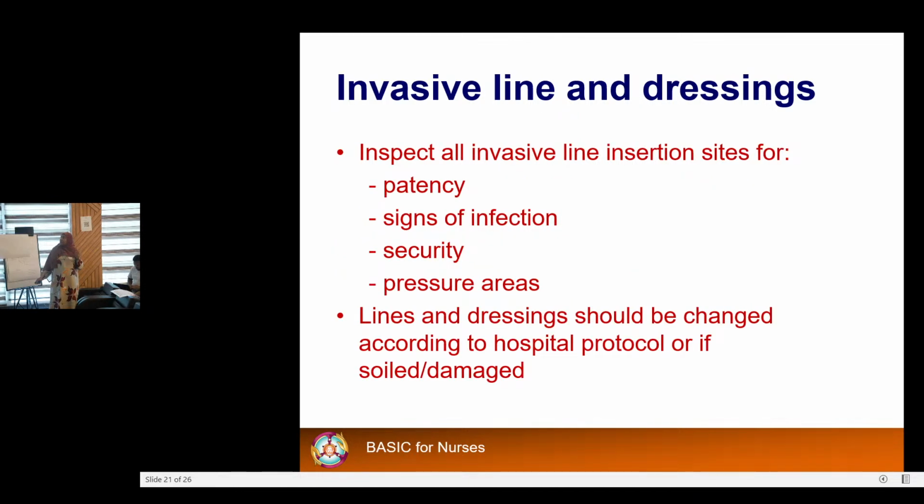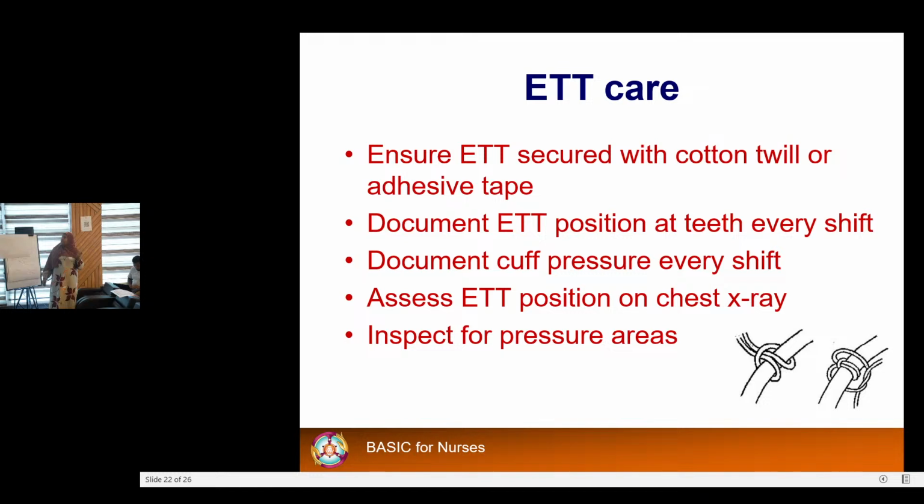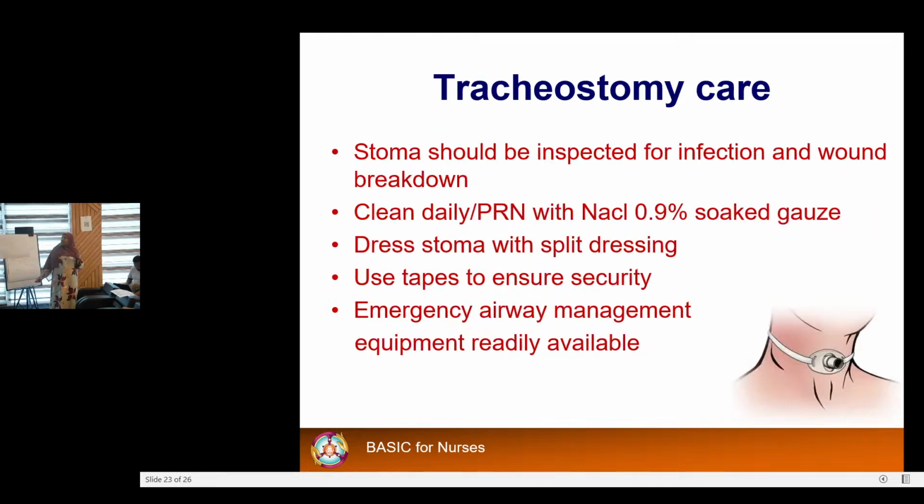Invasive line and dressing should be checked for patency, any sign of infection, pressure areas, security, and lines and dressing should be changed according to hospital protocols. ETT care, we have already said. Documentation is very important when you do cuff pressure for every shift. ETT positioning, we have already said that.